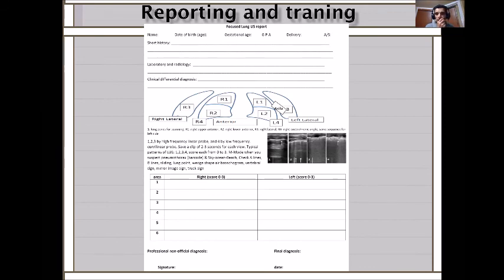Well, I thought that Dubai is a very rich city, so it makes sense. We have ultrasound machines, and it makes sense to have an ultrasound in every unit, but ultrasound is portable, so you just need more physical fitness to push it. You can use the same machine everywhere if you don't have one. You don't need expensive machines. They're only $1,500. It's a computer and a probe. You don't need more than that, and then you need a stand.